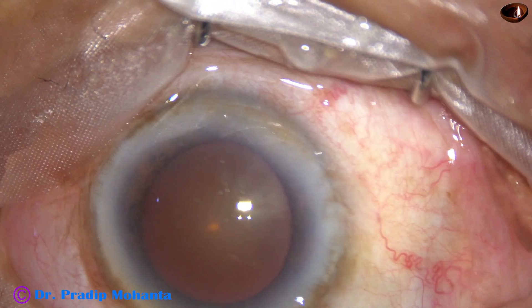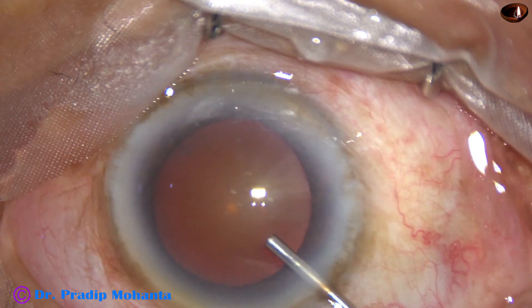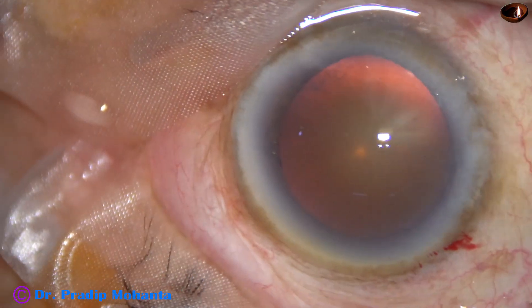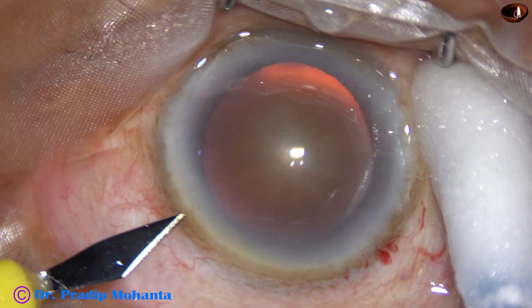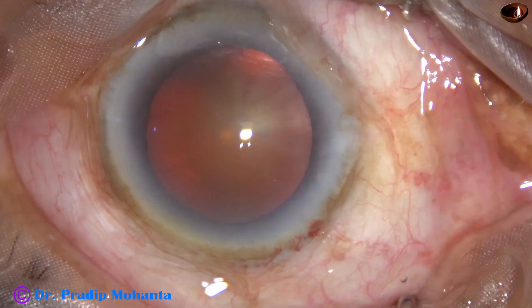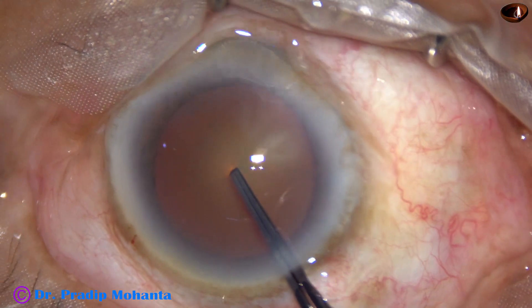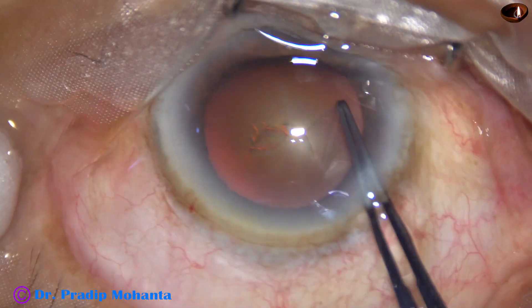We can see there is a thick arcus senilis. By this time the main incision has been made. Viscoelastic has been injected into the anterior chamber and applied over the corneal epithelium. And now this is a side port on the left side of the main incision. And now capsulorhexis. This is a utrata forceps. We are having quite good red glow.